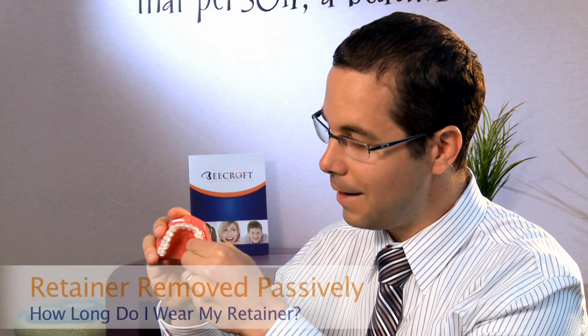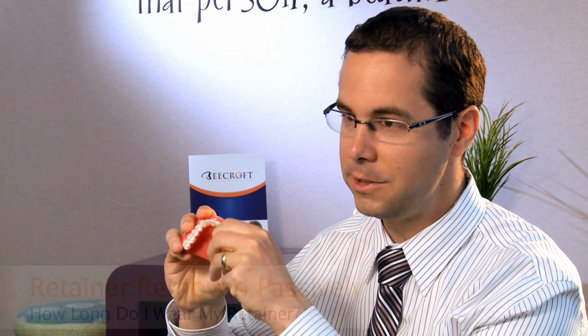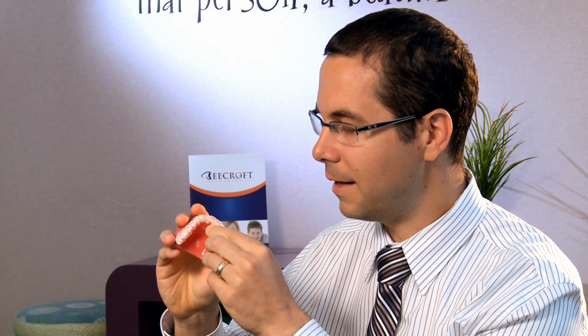After about a year of wearing them at night, I let people know that, okay, now it's your turn to be the orthodontist. When you take the retainer in and out, you want it to feel very, very passive on your teeth. So you don't want that tight feeling that, oh, hey, my teeth have moved during the day. You don't want that at all. And that's when you need to wear your retainer a little bit more. So if you have that passive feeling when the retainer comes in and out, then okay, I can get away with wearing the retainer a little less.